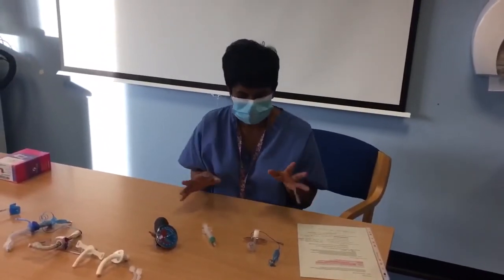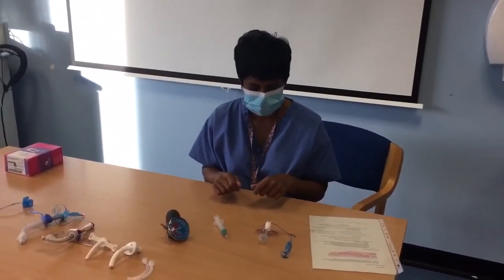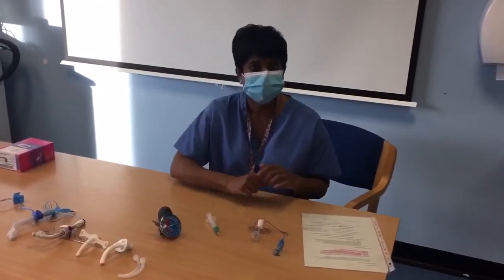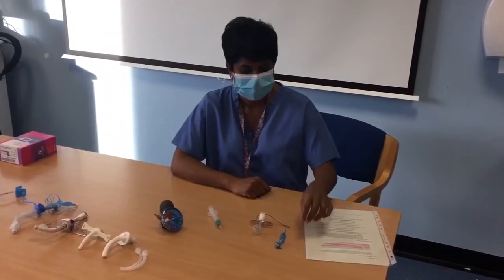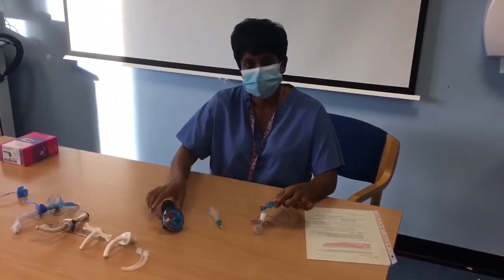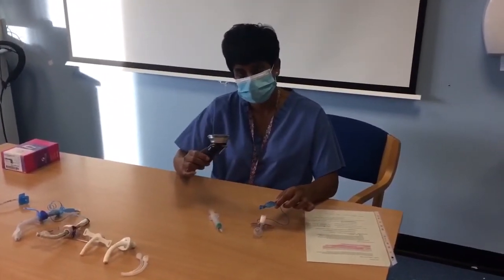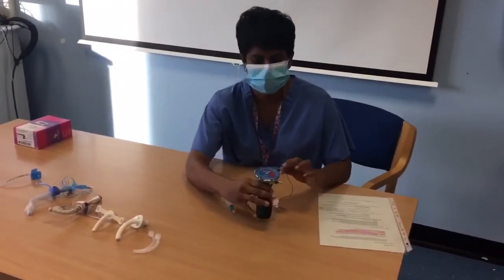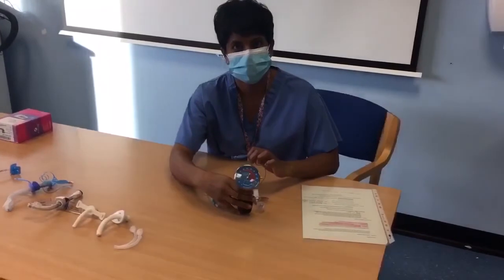Okay, so just a couple of safety points to mention. When we come on shift, we're going to check the pressure within the cuff of our tracheostomy tube. So to check the pressure, we're always going to use our manometer. Okay, and make sure that the needle is within the green zone.